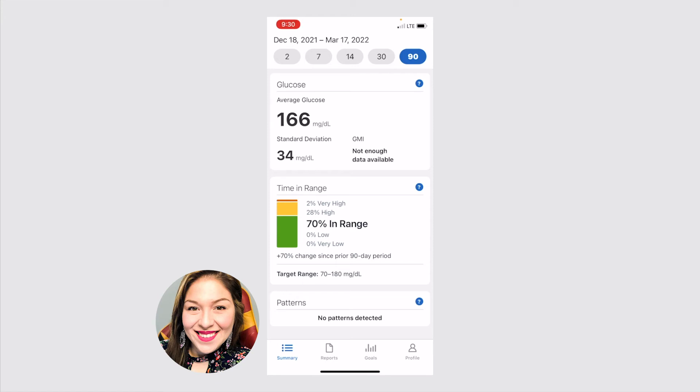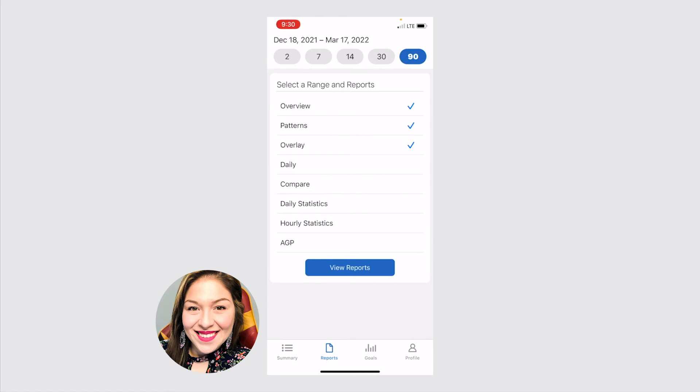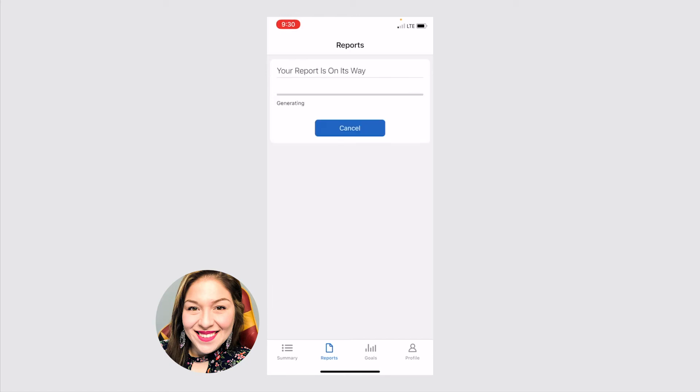This is the home screen, so this is just a quick summary, kind of a bird's eye view of what's going on with your blood glucose levels. You can click on reports here at the bottom and get even more specific details. So let's say for the 90 days, I want to look at a report that shows my overview, any daily patterns, and overlays. So you click view report.